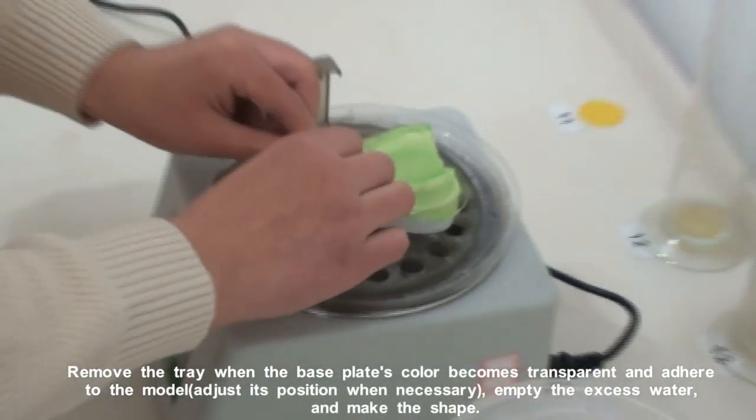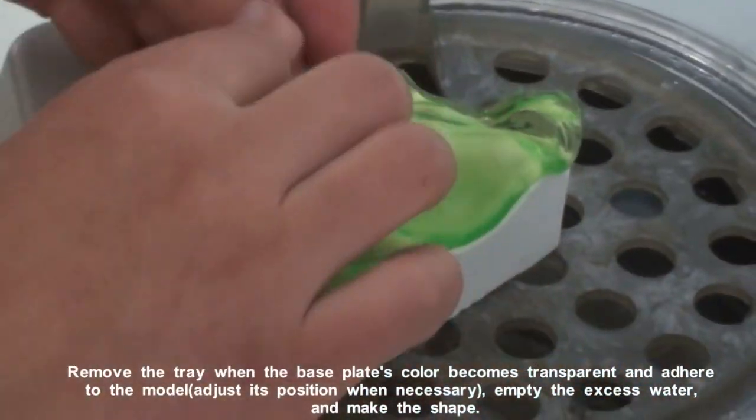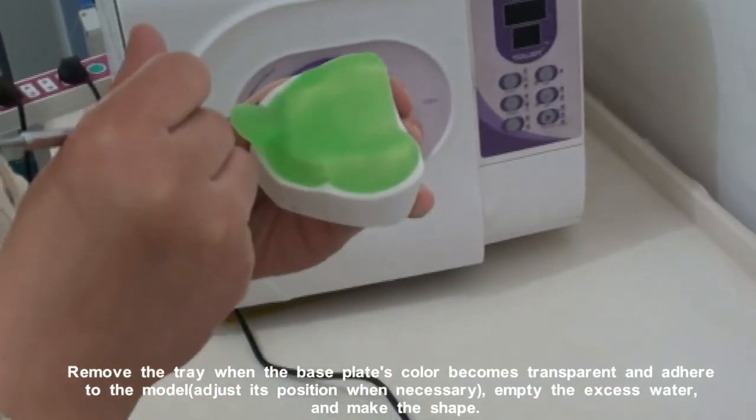Remove the tray when the base plate's color becomes transparent and adheres to the model. Adjust its position when necessary, empty the excess water, and make the shape.